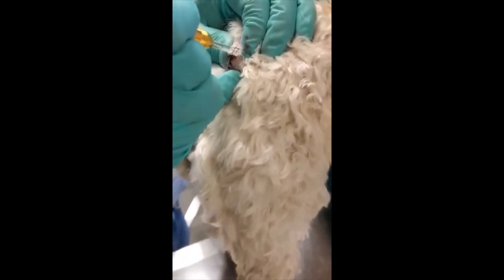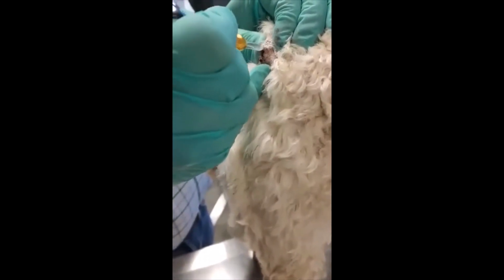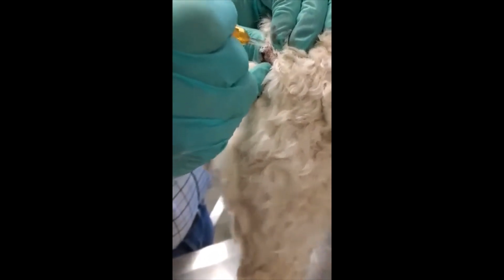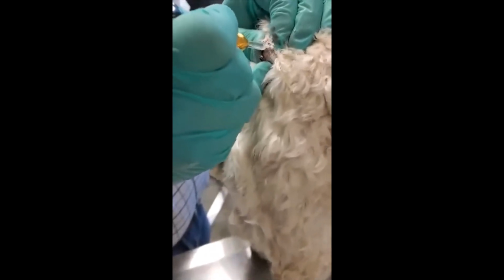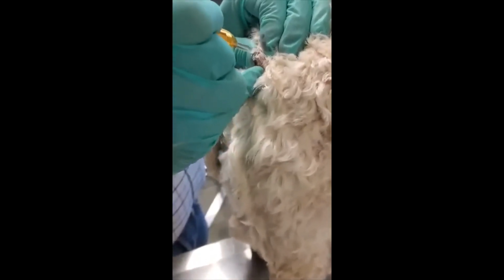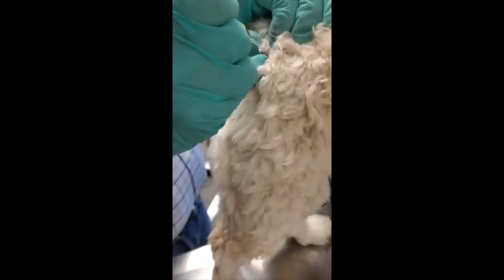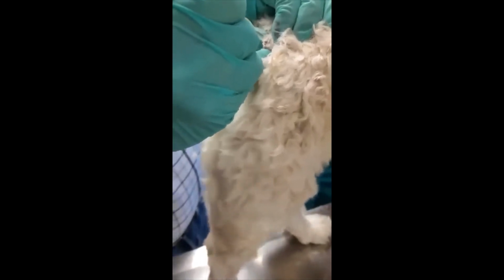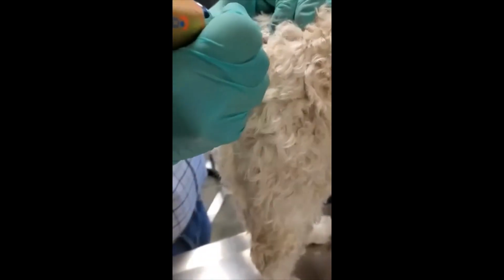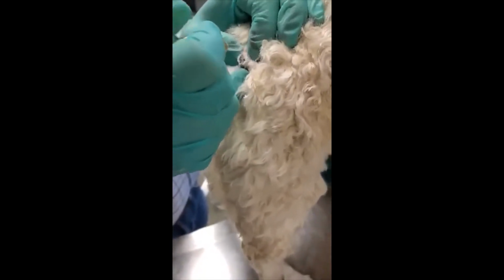Some of these are more tissue dense, and so we are extending the freeze cycle to 45 seconds. There are additionally some papillomatous masses on the distal limbs where surgical removal would be very difficult due to the lack of sufficient tissue for closure.